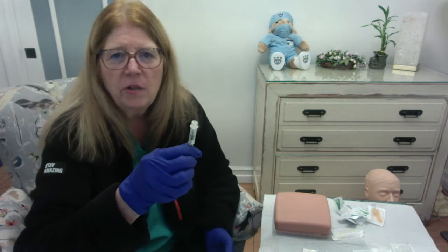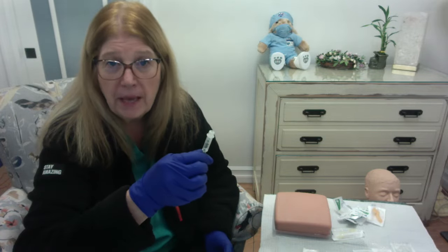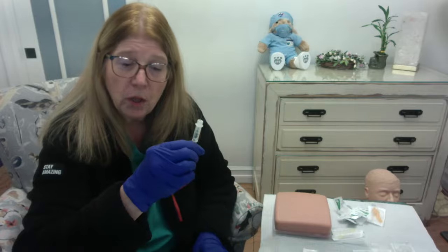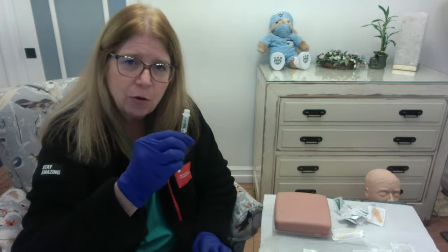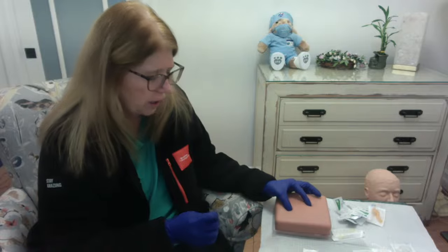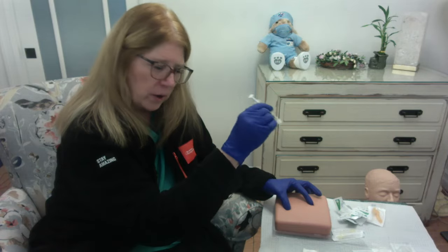Now, subcutaneous injections can be given at a 45 to 90 degree angle, depending upon your patient's body habitus. However, there is an asterisk there, and this is the exception to that rule. Insulin is always given at a 90 degree angle, always given at a 90 degree angle. Okay, so we're going to pinch up this skin. I'm going to take this syringe, and it's all in the wrist, okay? All in the wrist.